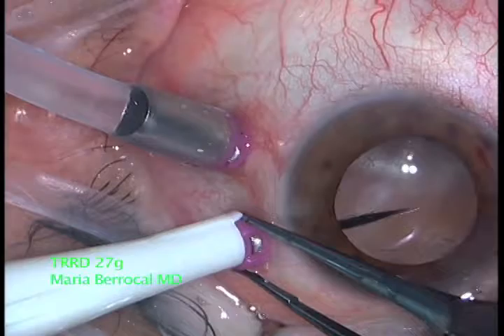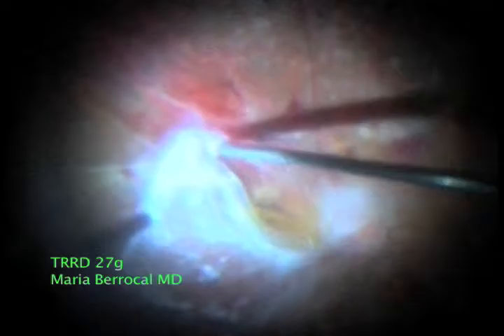Here we're inserting the trocar cannulas. The eye is pseudophakic.